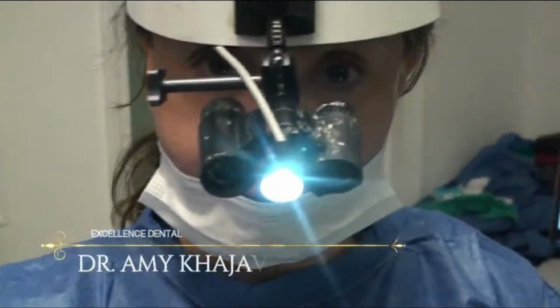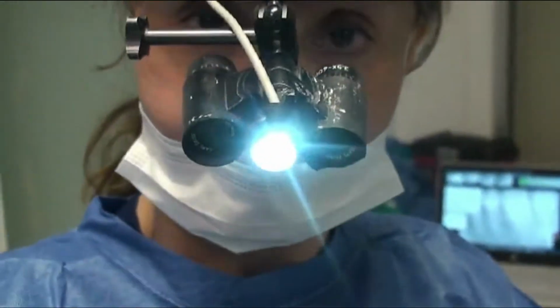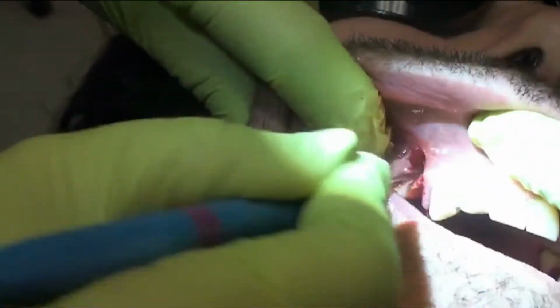Yeah, I love that sound. Once we get all the infected ligaments out, we get to the point of clean bone. That is amazing. It's a beautiful sound. Listen to this. See? That's what you want to hear.